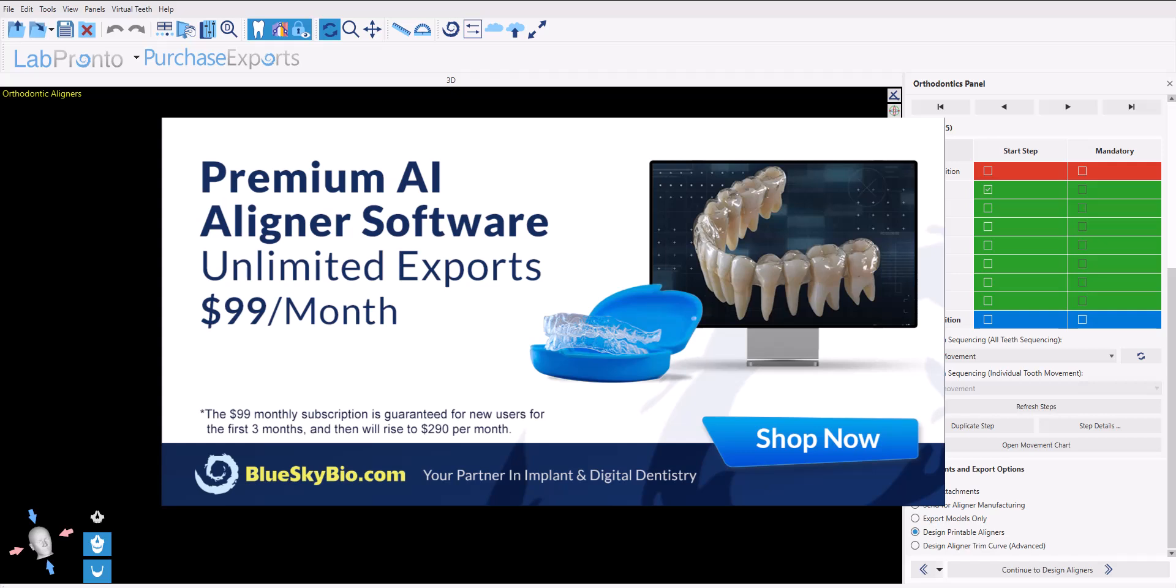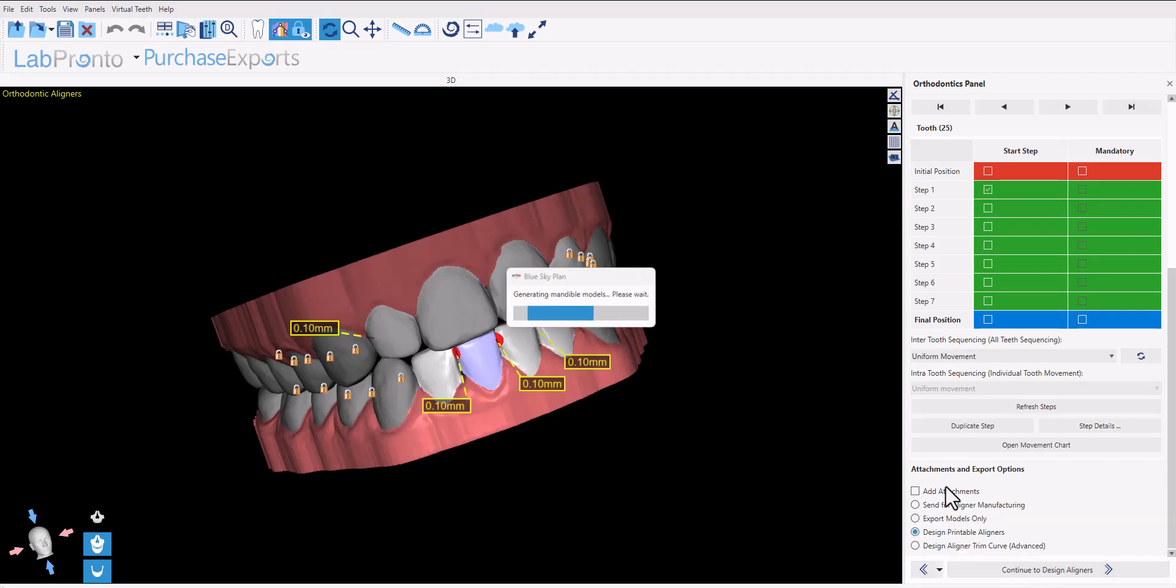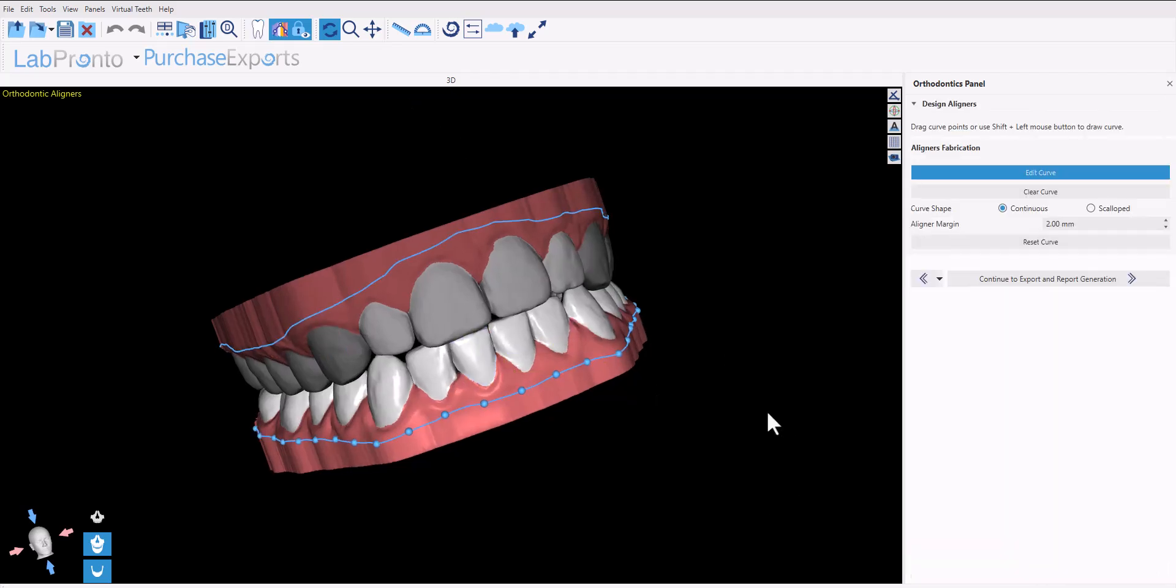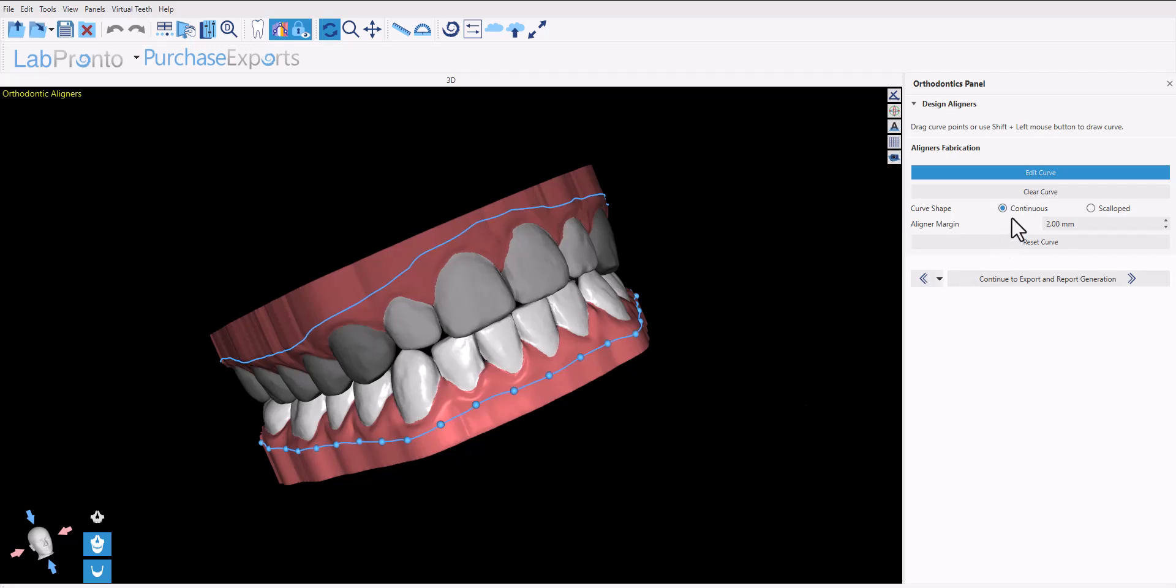Once you make the change to design printable aligners, click the button 'continue to design aligners'. We have two options: continuous or scalloped aligners. The curves are generated automatically. Of course, you can grab and drag any of the nodes to update the curve accordingly.